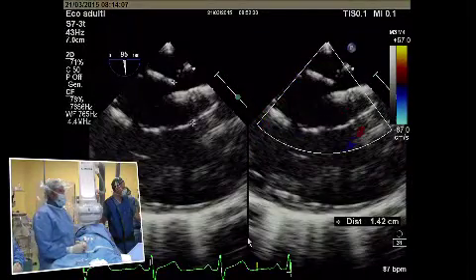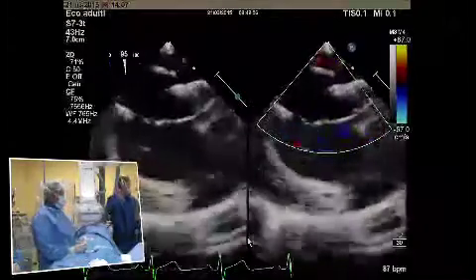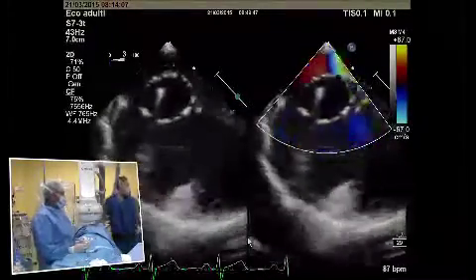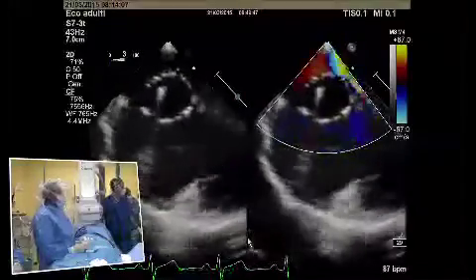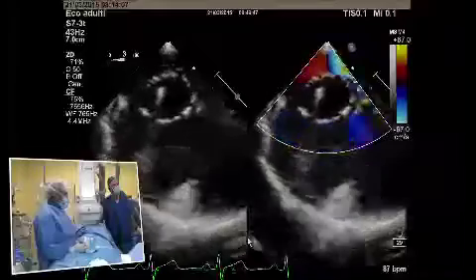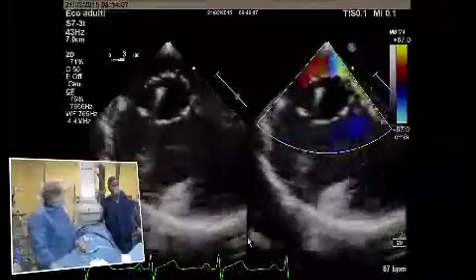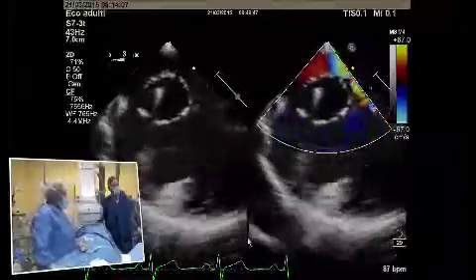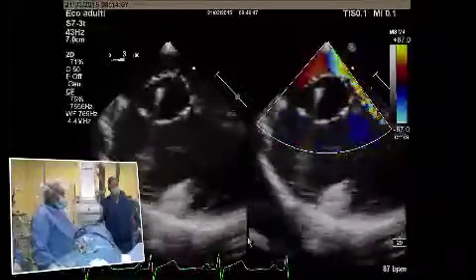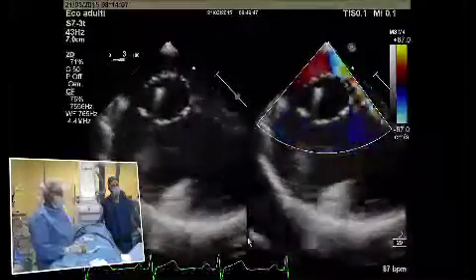I agree with you that in this kind of anatomy with pretty defined rims and very nice pictures on echo, balloon sizing is not mandatory. We do balloon sizing routinely, so it takes just a couple of minutes. So we actually did balloon sizing also in this case. And I showed you the picture now of the balloon on fluoro.